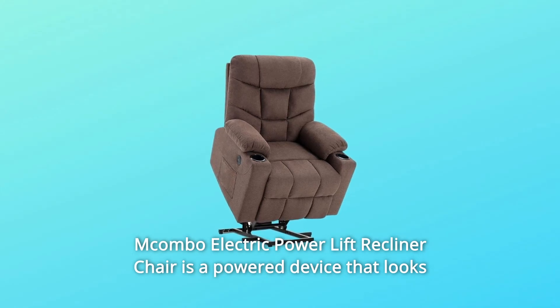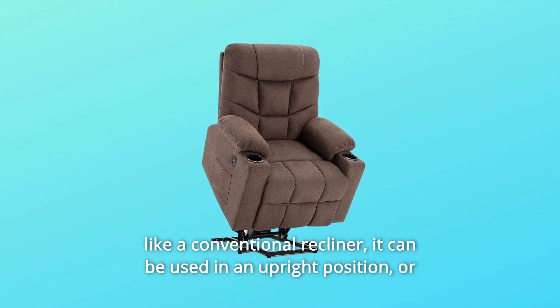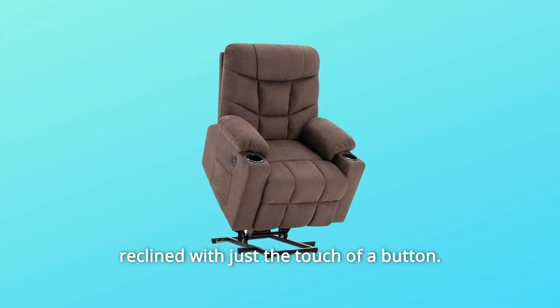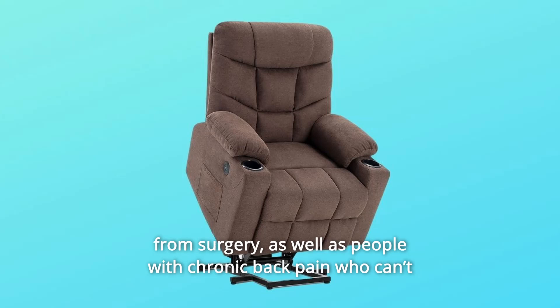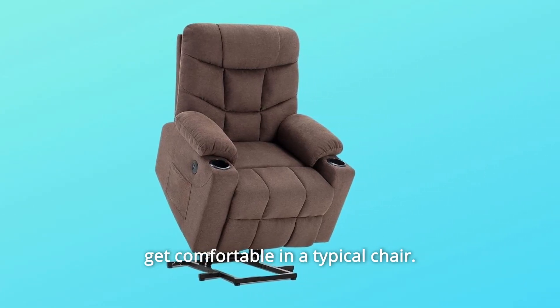The Mcombo Electric Power Lift Recliner Chair is a powered device that looks like a conventional recliner. It can be used in an upright position or reclined with just the touch of a button. It's an ideal solution for anybody who has mobility issues or is recovering from surgery, as well as people with chronic back pain who can't get comfortable in a typical chair.